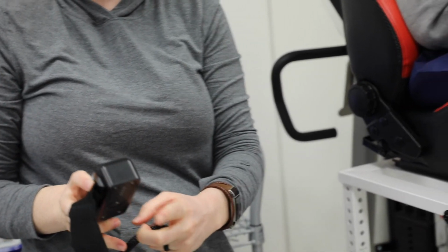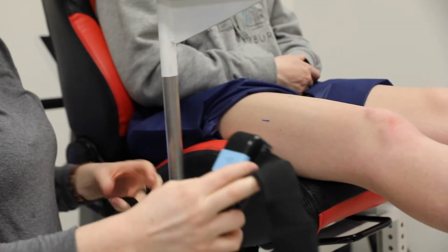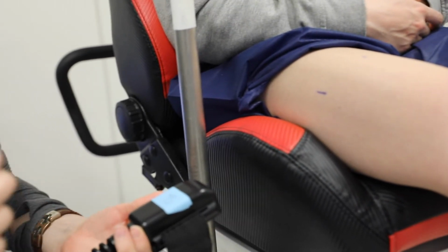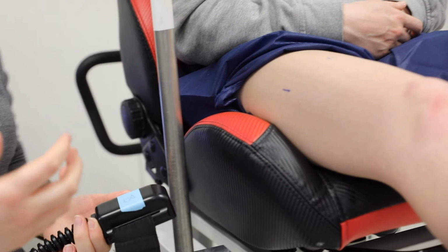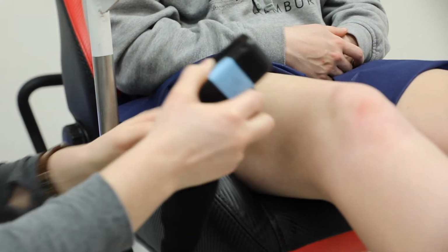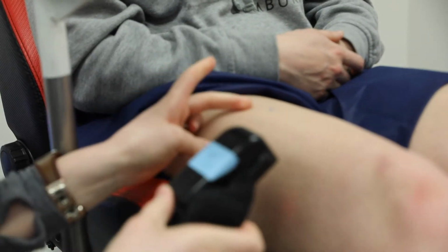So to get the probe on the subject, again, be careful that you don't show the bottom of the laser to the ceiling with all the lights, because that's where the laser is and we don't want it to get messed up by all the lights. Usually we'll have the subject in position for whatever we're doing. So if you're doing this during a bike test, you want them standing behind the bike so that they're already in position close enough to the bike that they can get onto the bike once this is on. Or if you're doing this while doing a resistance study, then you want them sitting here. You can just stay nice and relaxed. We're just going to make sure that this circle is in the middle of these two lines.